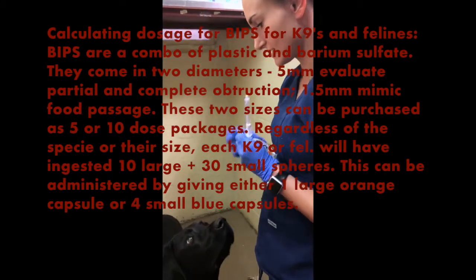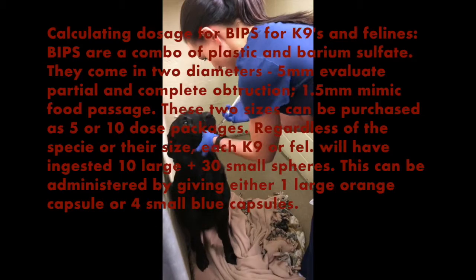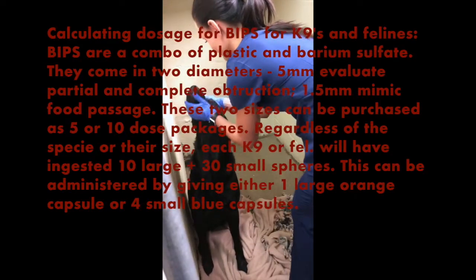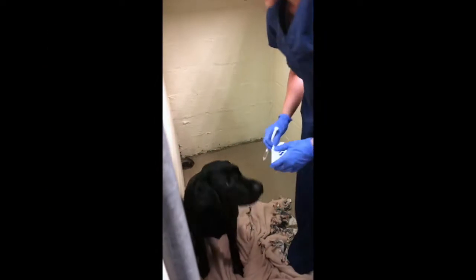Indications for GI series abdominal rads include vomiting, diarrhea, constipation, hematochezia, melena, abdominal mass, abdominal pain, foreign bodies, or post-abdominal trauma. Contraindications include special studies that shouldn't be performed if the patient has a fluid-filled distended esophagus or stomach, or if the bowel is atonic. In addition, patients with ileus due to torsion or other conditions are not ideal candidates.